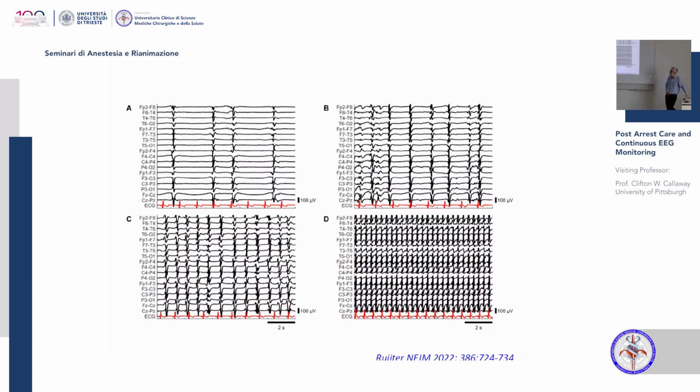These are some other tracings from there. This one actually shows the progression over time of somebody who starts suppressed, develops some epileptiform discharges that increase in frequency until down here they get so fast that you would call it a seizure. And be obliged to treat that because now they're in status epilepticus because it's more than a couple of times per second.